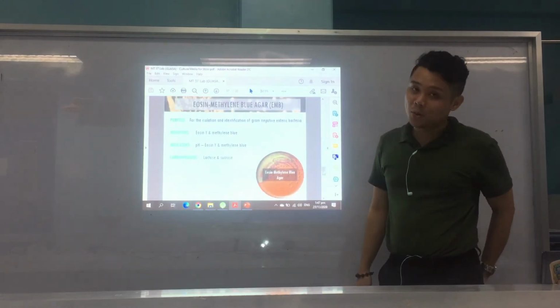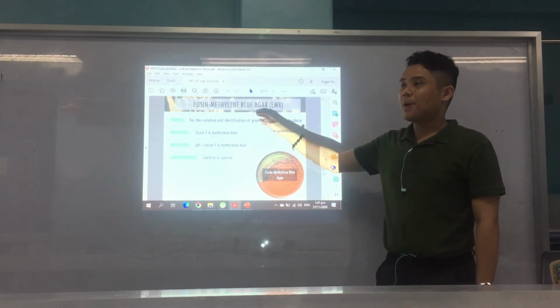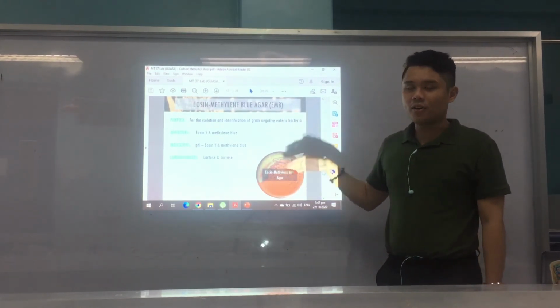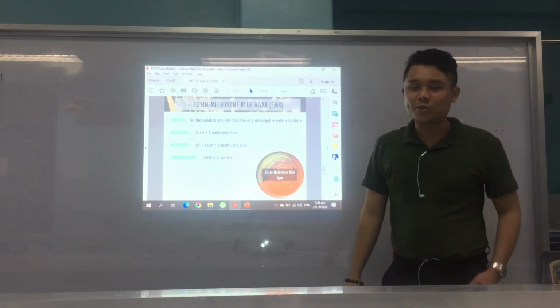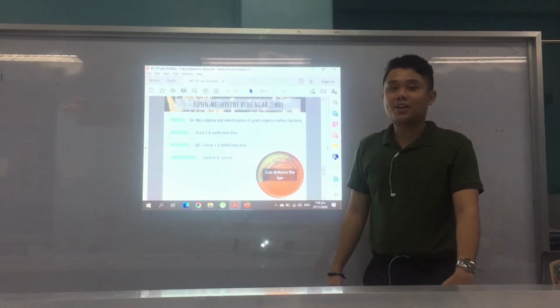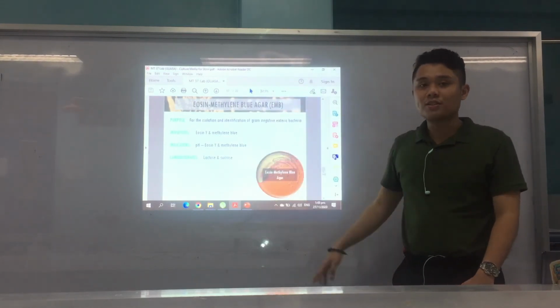Eosin Y and methylene blue. Okay? And carbohydrates, lactose, and sucrose. So, eosin methylene blue, or EMB, agar. Okay? So again, it's a general purpose medium that can isolate gram-negatives, usually for the gram-negative Enterobacteriaceae. Okay? Alright. And again, the inhibitors are the same as the indicators, eosin Y and methylene blue.